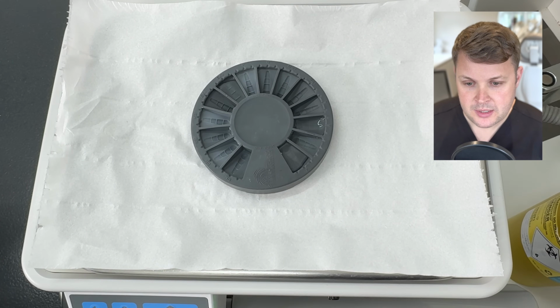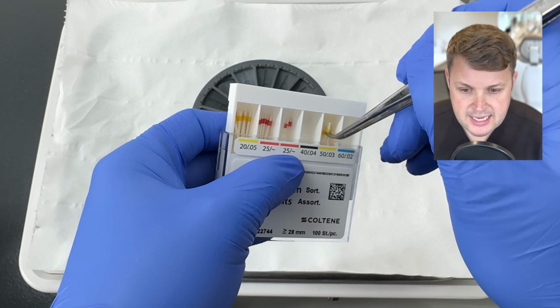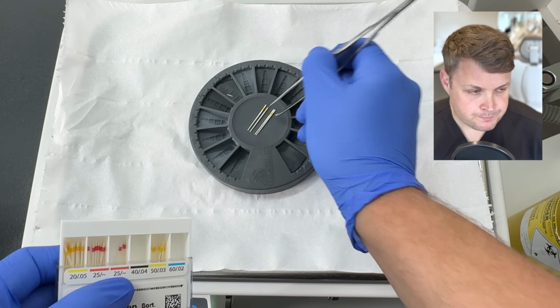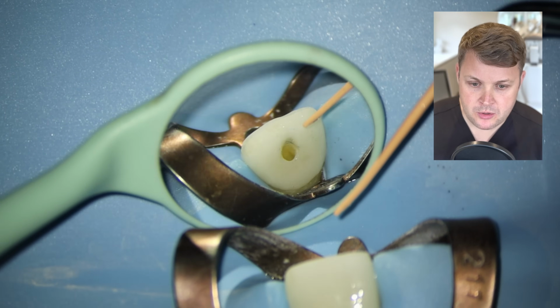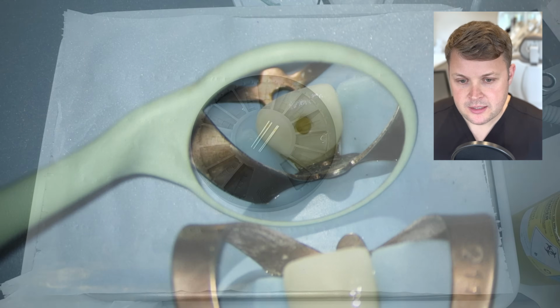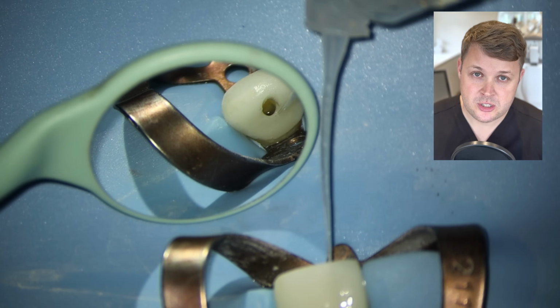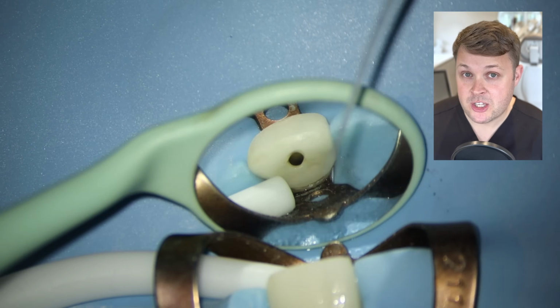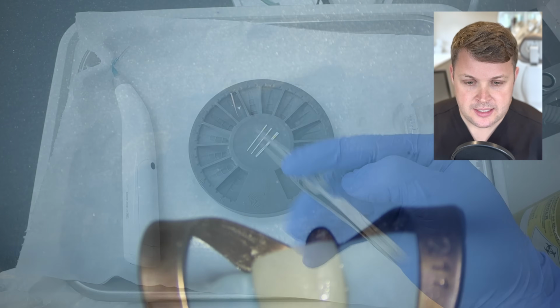And in this case, because it's quite a wide open apex, I'm going to use these size 50 paper points. Downside to this is these are not sterile, but I'm still happy. We're going to remove the GP cone. We're going to place that into our disinfecting ring, and don't forget the GPs are usually not sterile in most cases because they just lie on them in a box, so they need to be placed into sodium hypochlorite. And then we're going to do our irrigation protocol, which is sodium hypochlorite activated, EDTA activated, sodium hypochlorite activated.